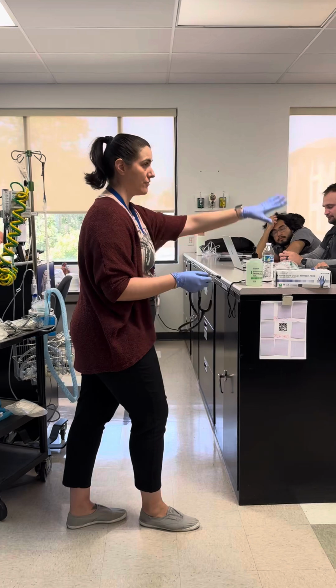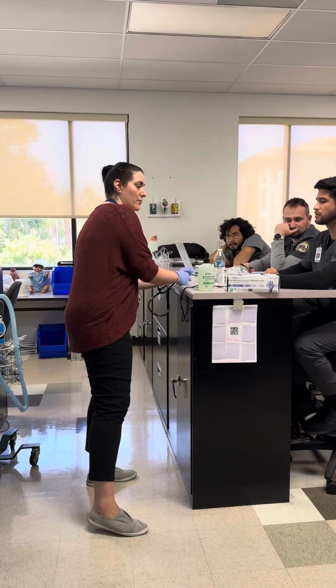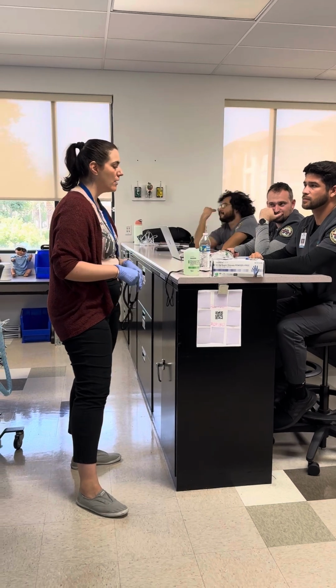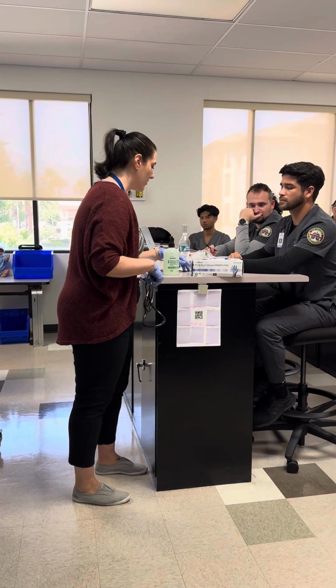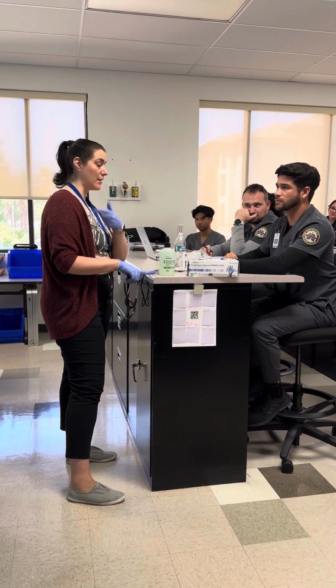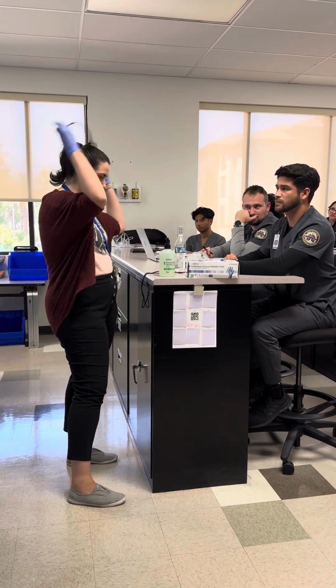So at that point, I'll have just checked the breath sounds. I'll come to my documentation and write down what Miss Bernier whispers to me. Let's pretend I'm actually wheezy right now. Then I'm going to come to my pulse oximeter, see that he's sitting at 96%. I'll say, okay, I see that the pulse ox is 96. Let's pretend like I'm sitting at 86% like the scenario says.